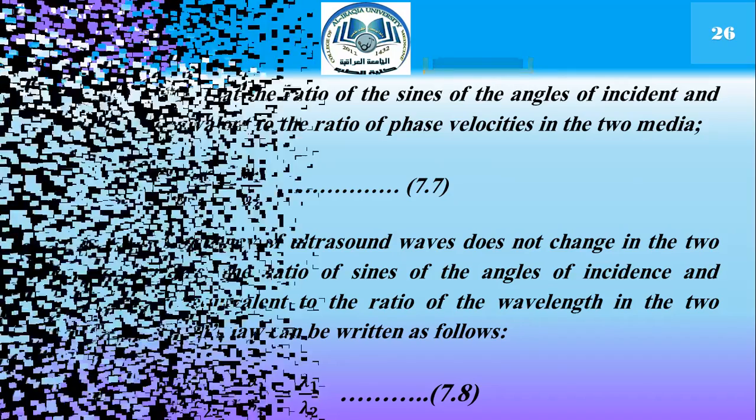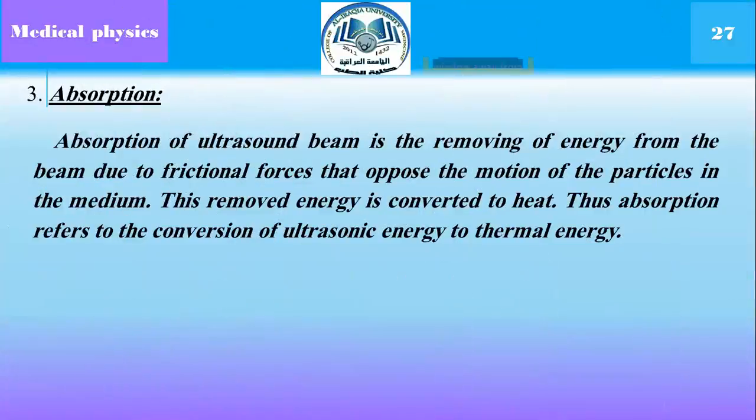Number 3, absorption. Absorption of an ultrasound beam is the removal of energy from the beam due to forces that oppose the motion of the particles in the medium. This removed energy is converted to heat. Absorption is the irreversible conversion of ultrasonic energy to thermal energy.